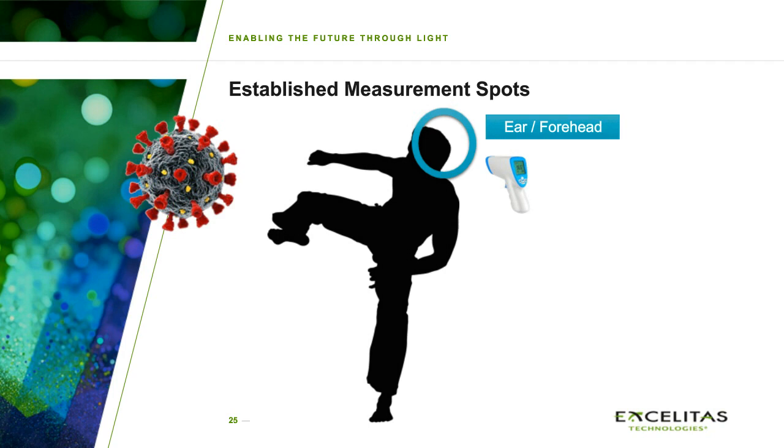You would need even a longer focal length, which elongates the whole package of the device, and then you get into troubles again with the thermal uniformity at the sensor. So it is simply not recommended measuring in a very long distance.